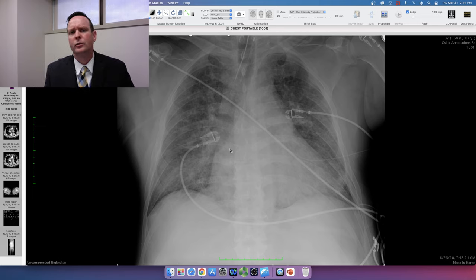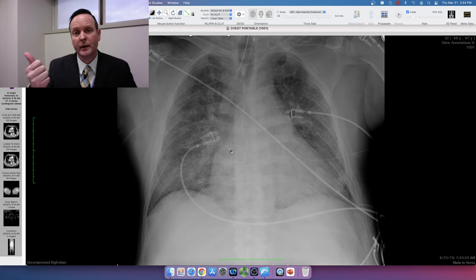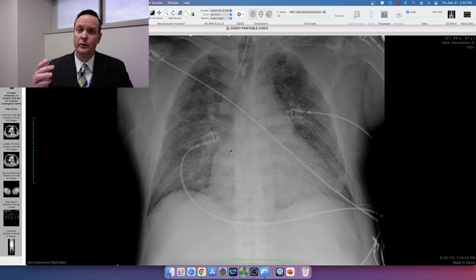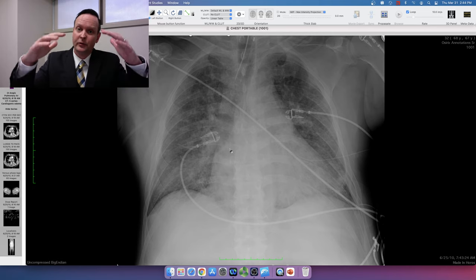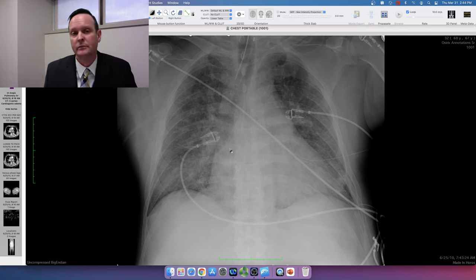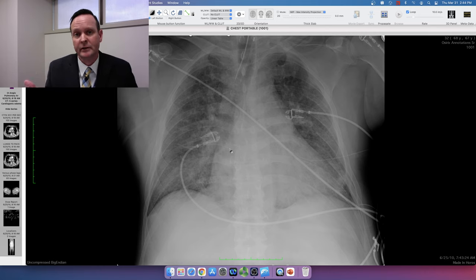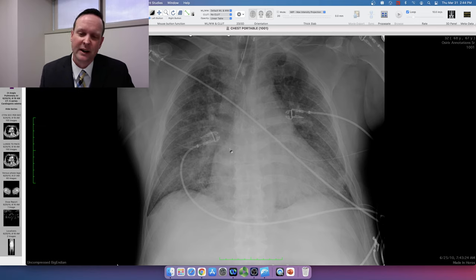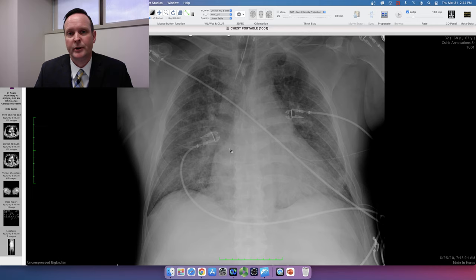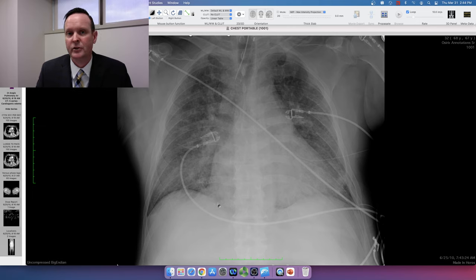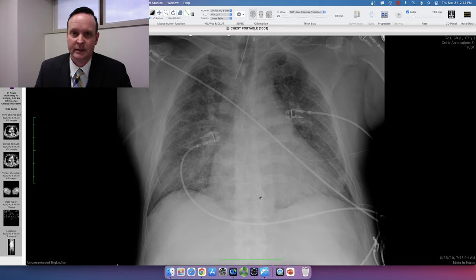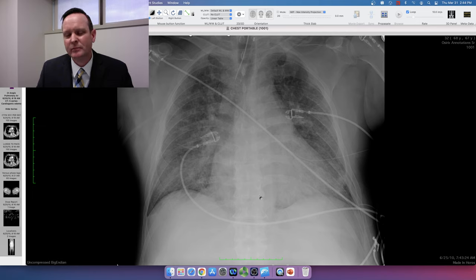There are five things I look for in cardiogenic pulmonary edema: cardiomegaly, vascular redistribution where pulmonary vessels distend in the superior lung, consolidation either perihilar or bibasilar, interstitial thickening, and pleural effusions. The combination of consolidation and interstitial thickening is very characteristic of pulmonary edema, and in this clinical setting that would be my leading differential. Atypical infection could also have this appearance.